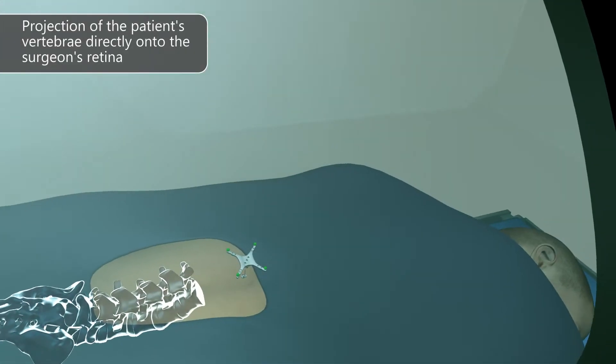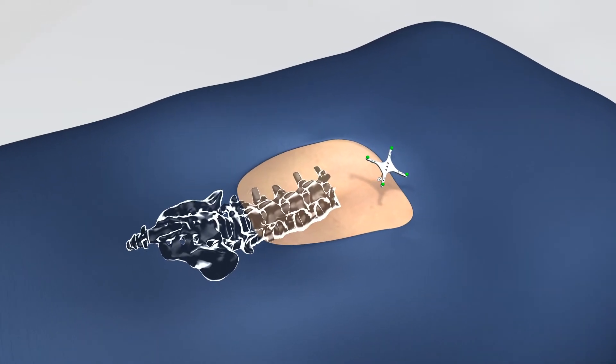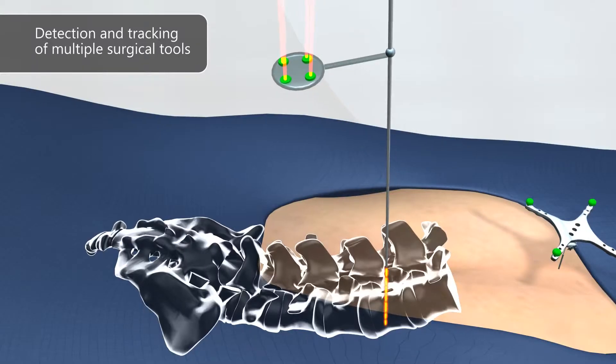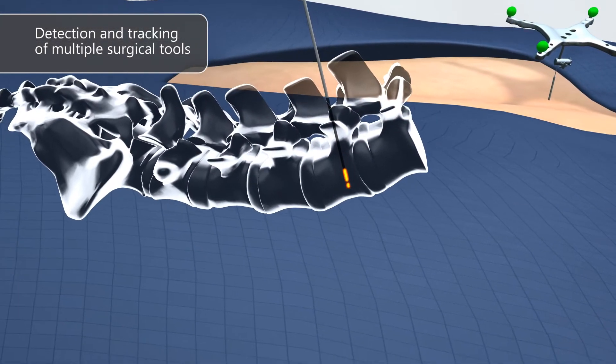The projection provides surgical precision with outstanding depth perception. The visor tracks the surgical tool and aligns it with the patient's 3D spine model to allow accurate drilling into the vertebrae.